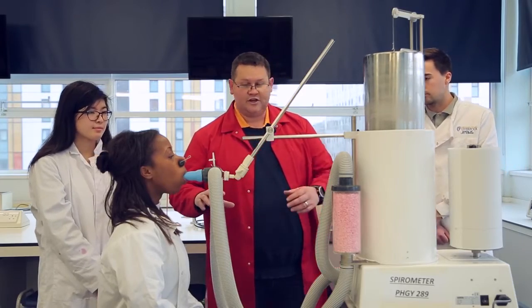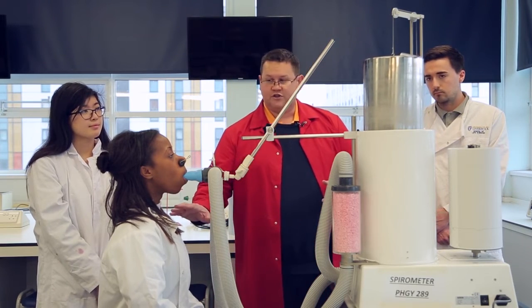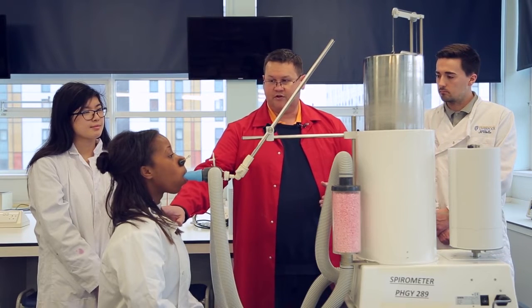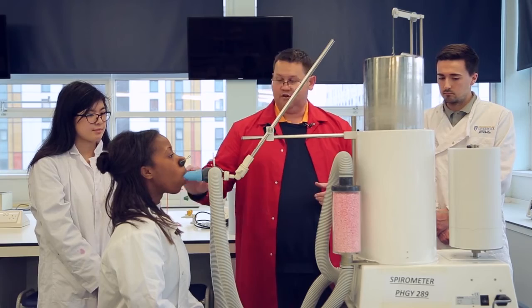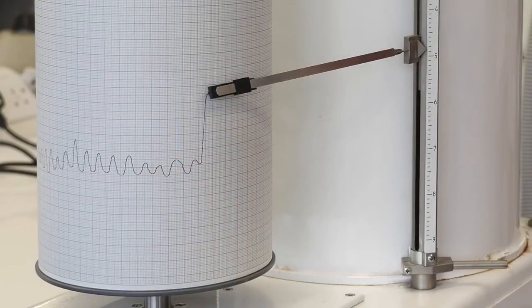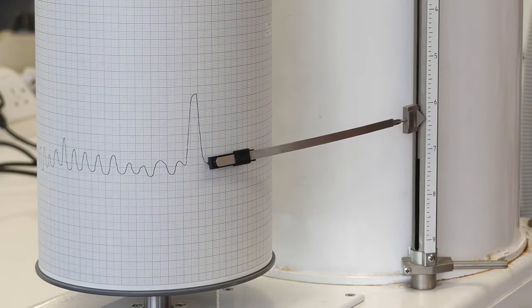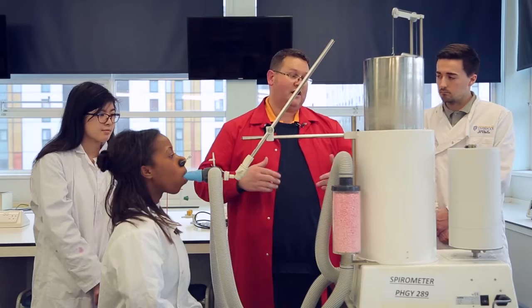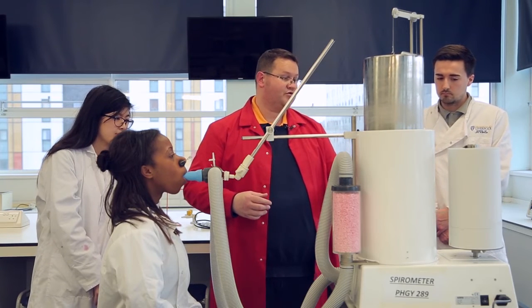So what I'm going to ask you to do is carry on breathing normally — you've got some good tidal volumes. When I ask you to, and I'll tap you on the shoulder to give you an indication, I want you to take the biggest possible breath in you can. So if you can do that now for me please — okay, and then blow that out, and stop and go back to normal breathing there please. What we've done there is looked at an inspiratory volume, and it'll give us an idea of inspiratory capacity and an inspiratory reserve.